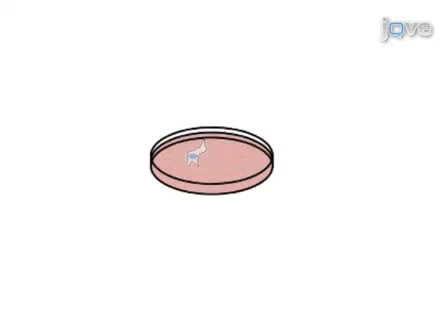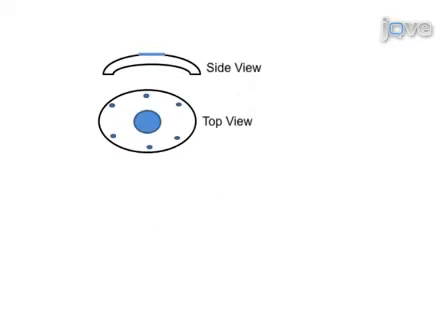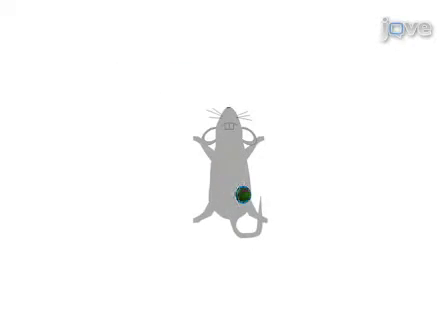This video illustrates a protocol beginning with the injection of a fluorescent protein-expressing tumour cell line into the mouse mammary fat pad. A specialised chamber for in vivo imaging is constructed and then surgically implanted into the animal, at which point imaging data can be acquired.